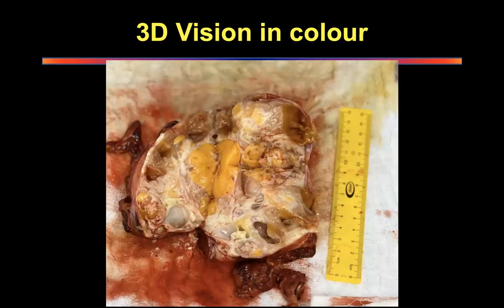Now, I'm going to give you a technique of how to learn to describe a CT. Okay. Now, Bhushan, what I want you to do is imagine that you are talking to a blind man. You are describing to a blind man. The audience is a blind man. And the blind man has never seen this structure.